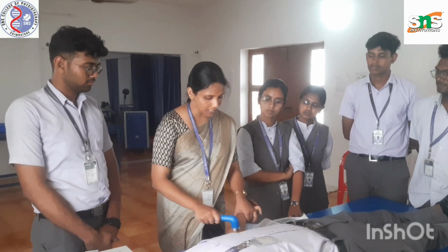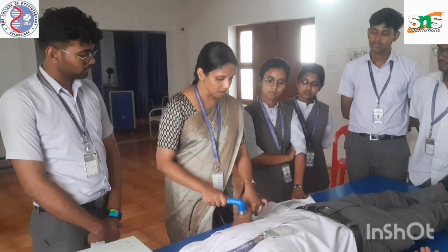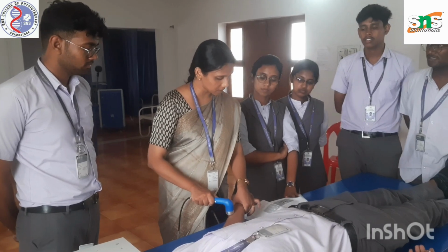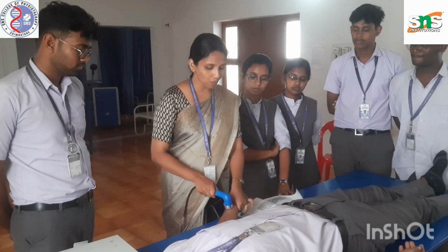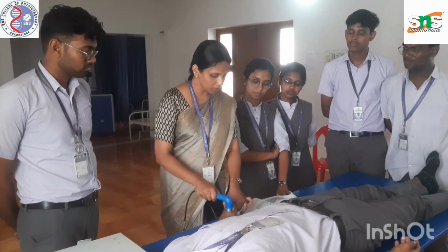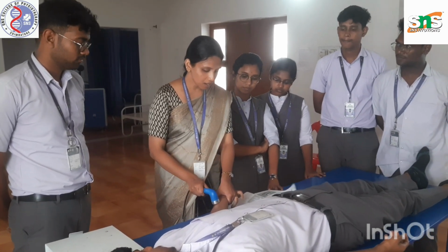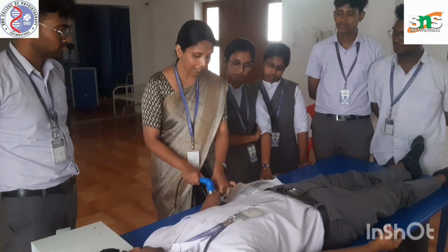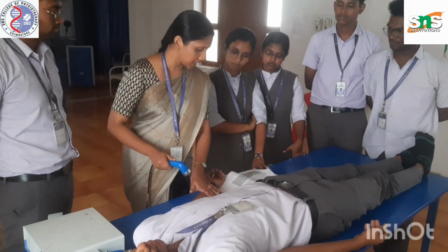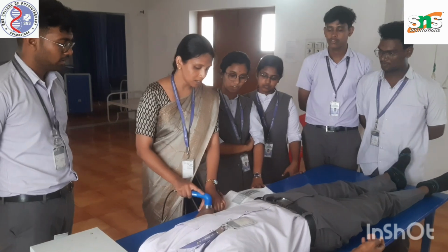The one is concentric circles. The transducer head has to be placed on the tissue, then it has to slowly move in a concentric circular manner. The next one is the figure of 8 way. The same circular motion has to be applied, but the transducer should not be taken out of the tissue. This should be in a smooth way. You can make an 8-like figure on the tissue. We can apply coupling media on our skin and then start our techniques. So one is circular, the other one is the figure of 8.